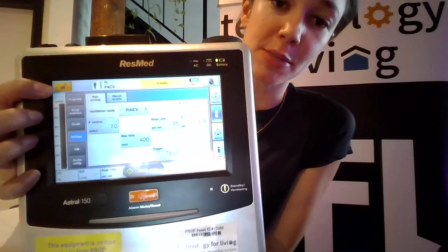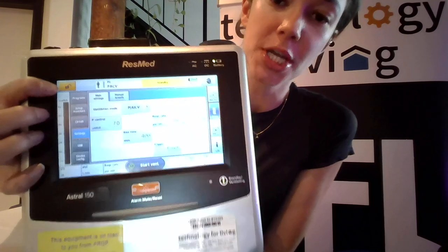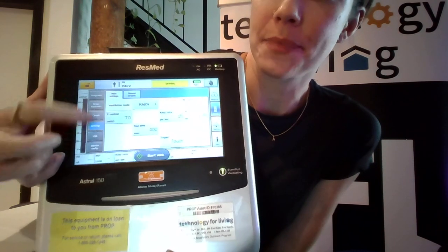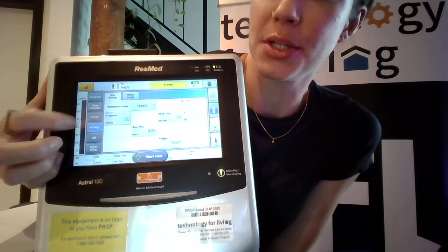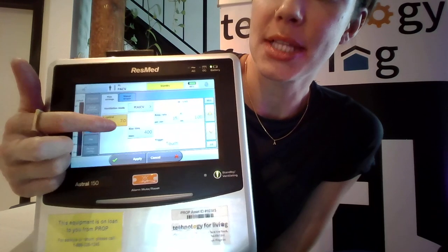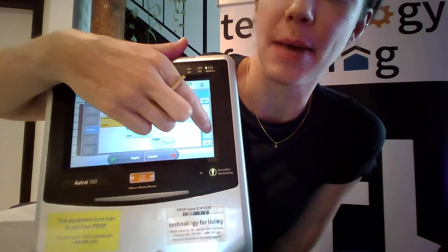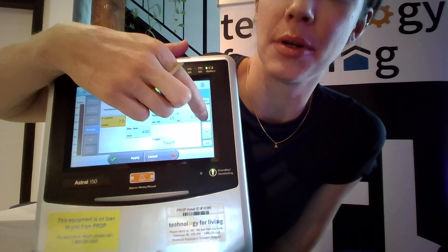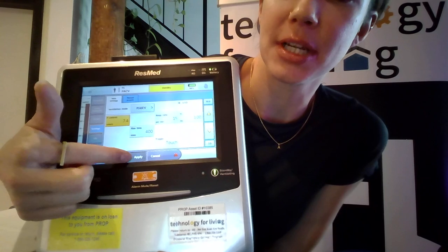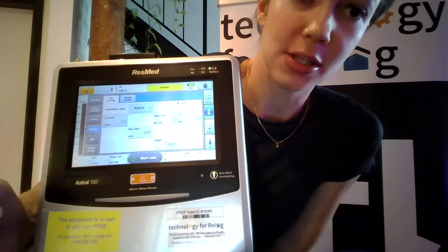Now you can see our symbol is unlocked and that symbol has turned to orange. We've got all of our menus here. When we go into settings and click on something, it's going to highlight in orange, and we get arrows here to turn values up and down. Anytime anything is changed, we do have to click Apply to make sure that new setting is locked in.